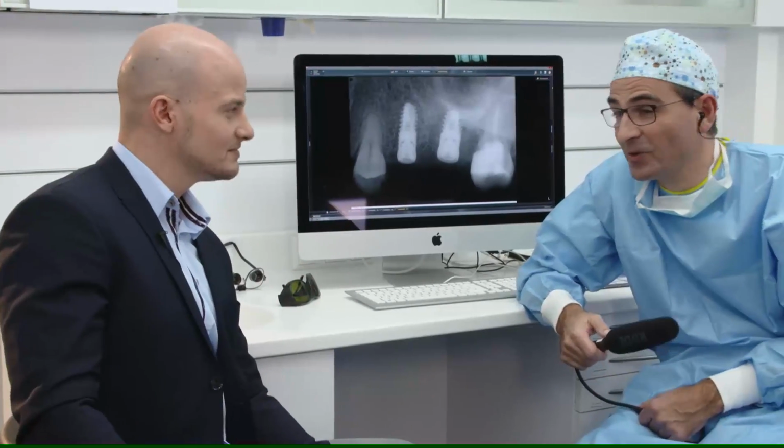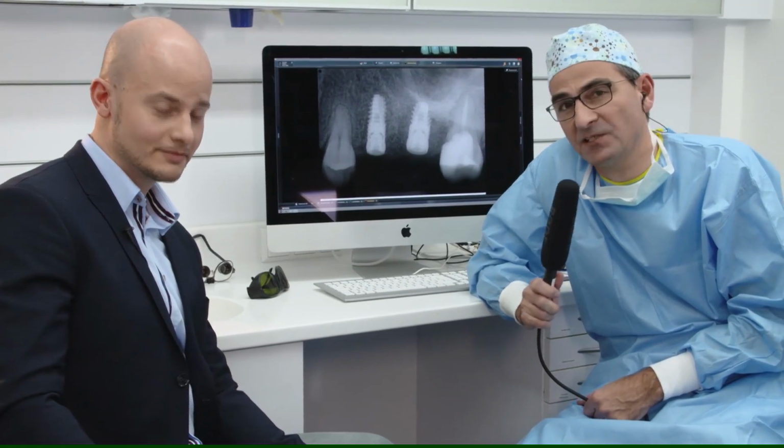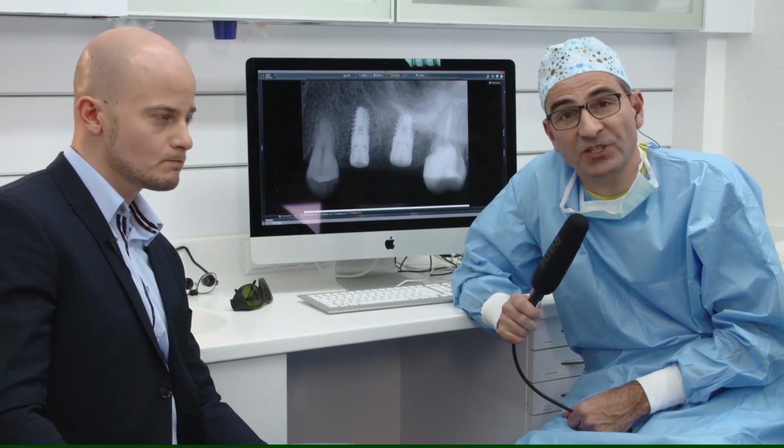Congratulations again. Thank you very much again, Frank. And don't forget, we have done a lot of videos around this case, and we will bring you the follow-up, all the pictures, and what we are doing with the CEREC machine when the 4 months are done.